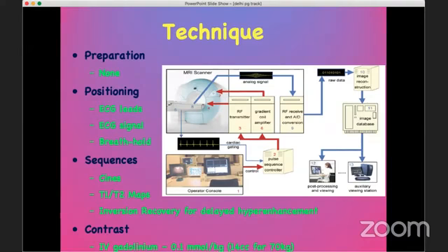And this is the typical workflow in the MR suite. I will just start here from the operator console. He gives the sequence which is required to the pulse sequence controller, and that has access to the RF transmitter and the gradient coil amplifier, which is inset in the MR. And what this does is create a new magnetic field. We know that the magnet never really stops, so there is an intrinsic magnetic field already there. The RF transmitter then changes the homogeneity so that we get these signals.